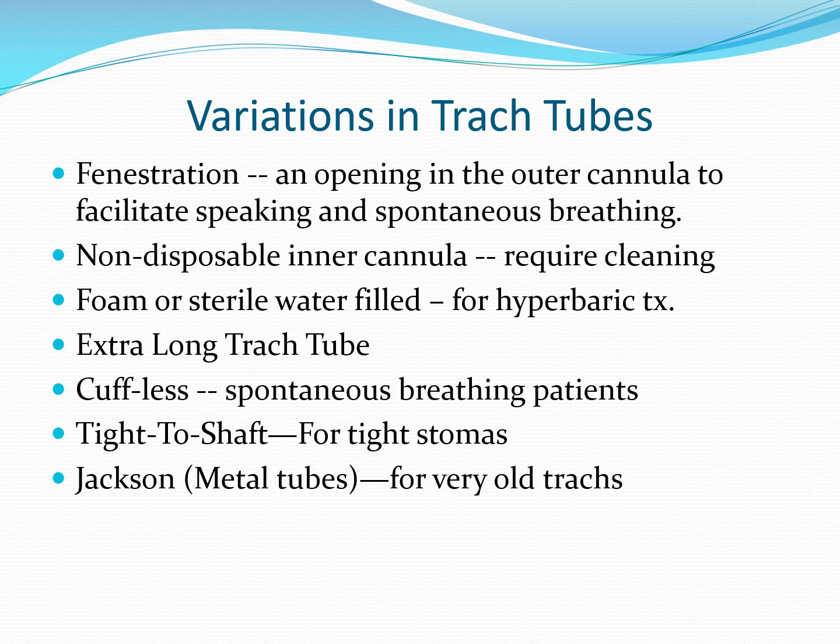The idea there is some folks have very narrow stomas. You have less risk of the wrinkles, or folds, in the cuff interfering with a tube change. So individuals that have had problems in the past may be switched over to a tight to shaft to better facilitate the insertion and the changing of tracheostomy tubes.